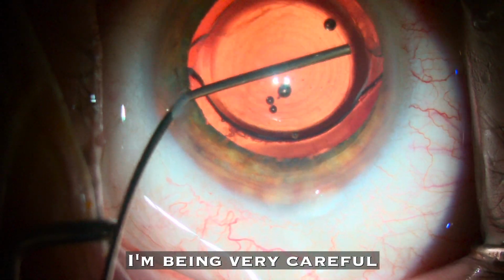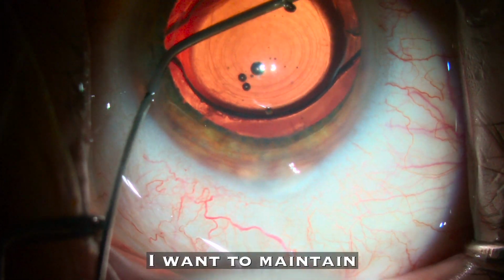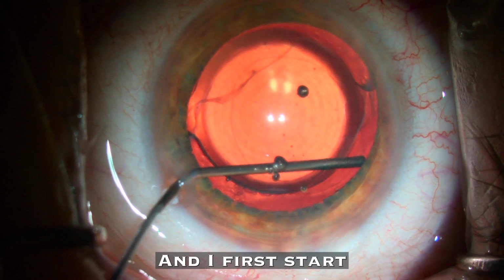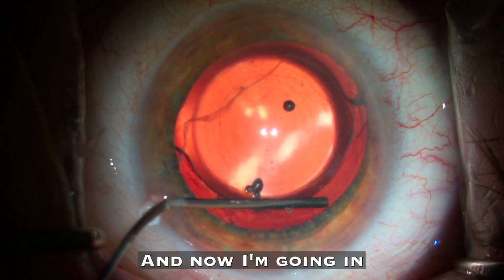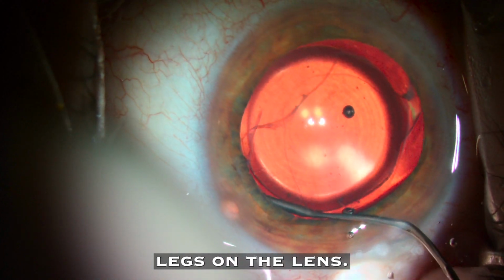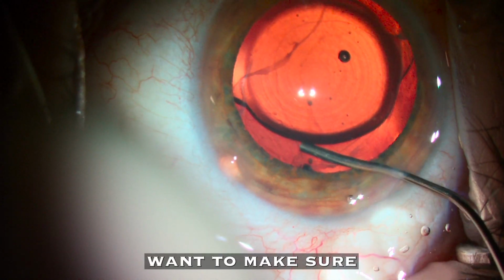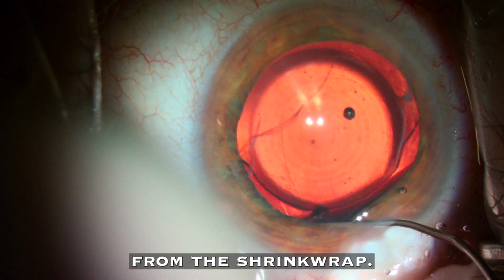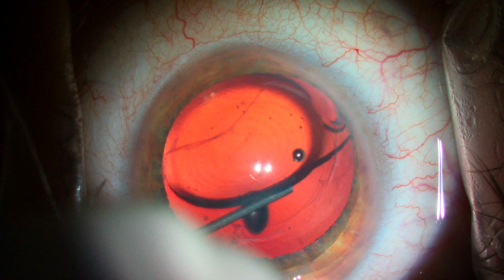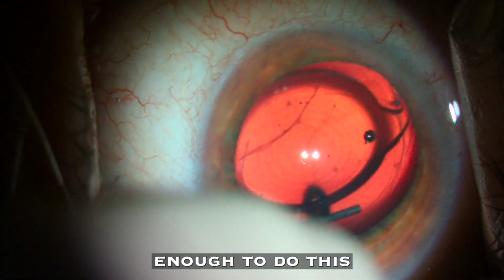So I'm taking my time. I'm being very careful here. I do not want the bag to split open. I want to maintain its integrity as much as possible. And I first start by getting the optic freed, and now I'm going in and targeting the haptics, which are the little legs on the lens. And I just want to make sure that the lens is nice and freed up from the shrink wrap so that when I move it, I don't tear the shrink wrap, so to speak. So I've lifted the lens up. I feel pretty confident that it's free enough to do this little maneuver.